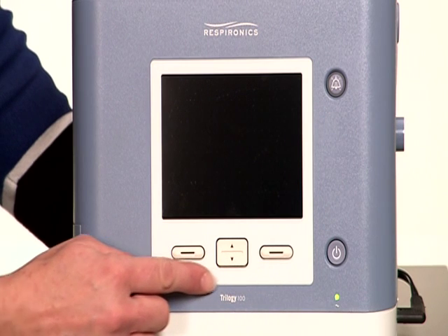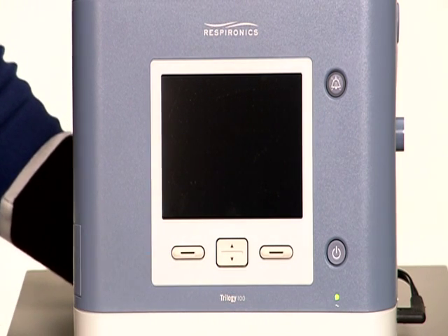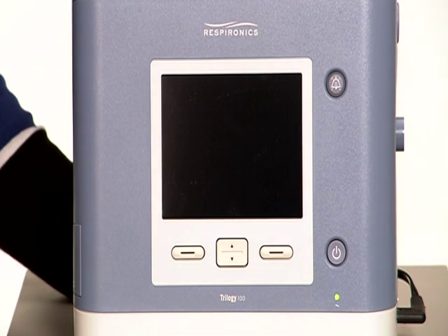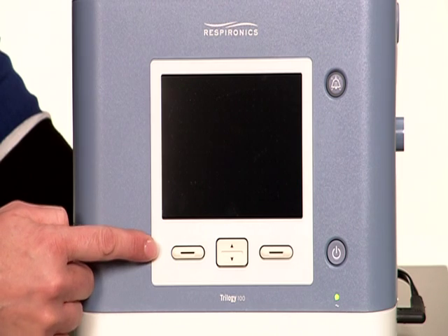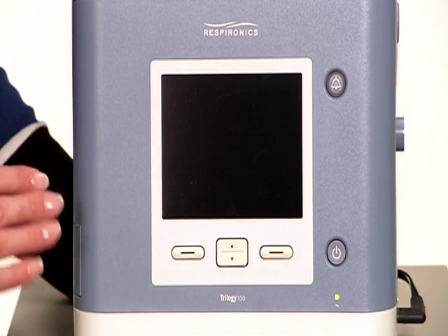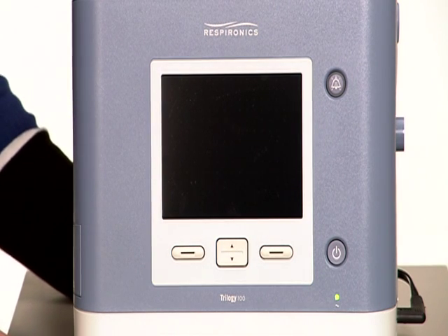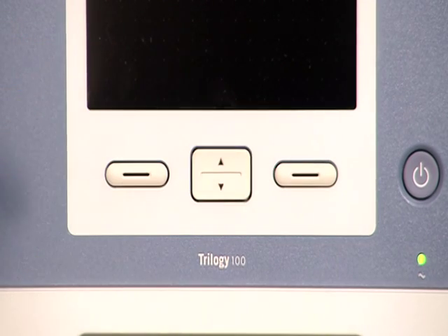Here, underneath the display screen, there are 3 white buttons. The up-down button in the center lets you move through the display menu and edit device settings. The left button is used to select display and menu options, which appear on the left side of the screen. The right button does the same for options on the right side of the screen.